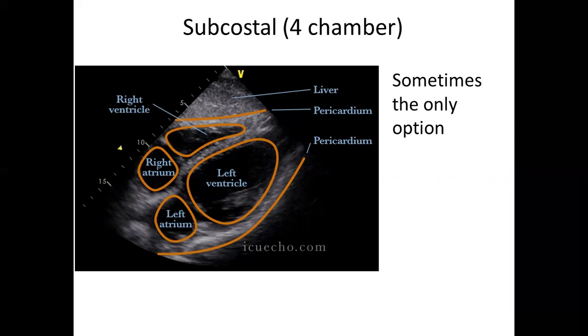These are very dense structures, such as bones and calcification, and it may be some very airy, gas-containing structures, since in both of these cases we don't have any distribution of the US wave further deeper into the thoracic cavity.